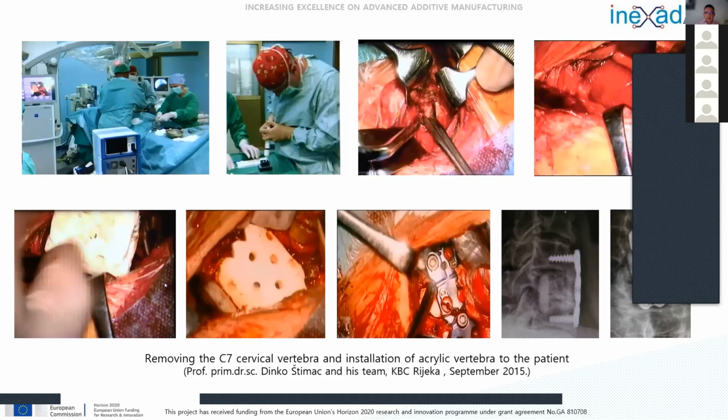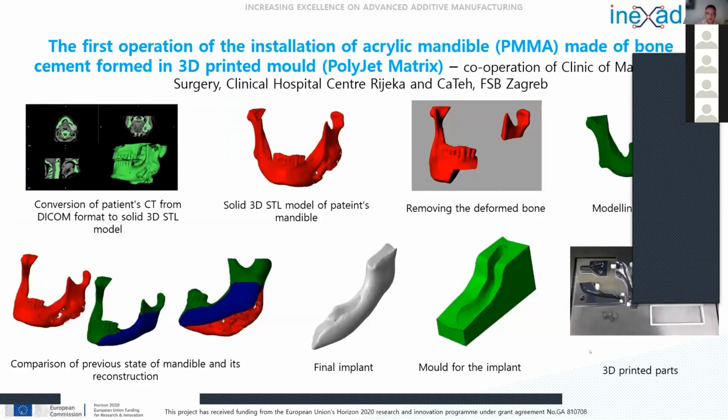And if this happens, the surgery is finished for him, not for this day, but for maybe a few days, so that he needs to recover, and his wound must recover completely before he can step into surgery again. So in this case, there is no such danger for the surgeon to be injured.